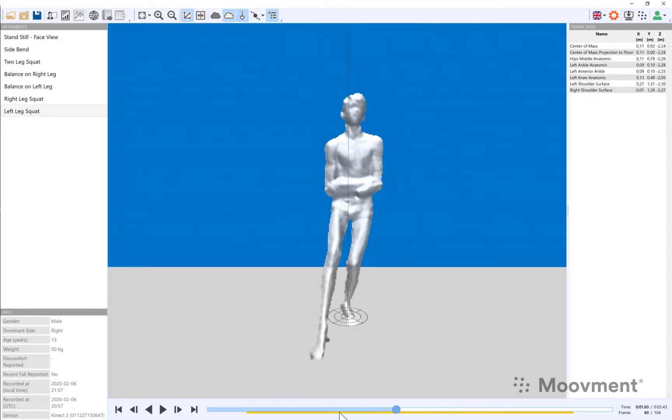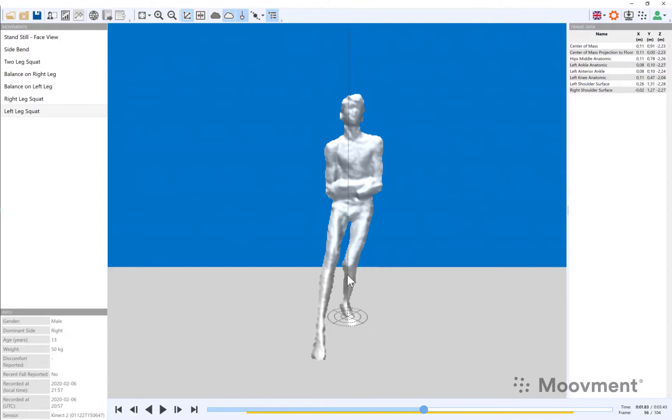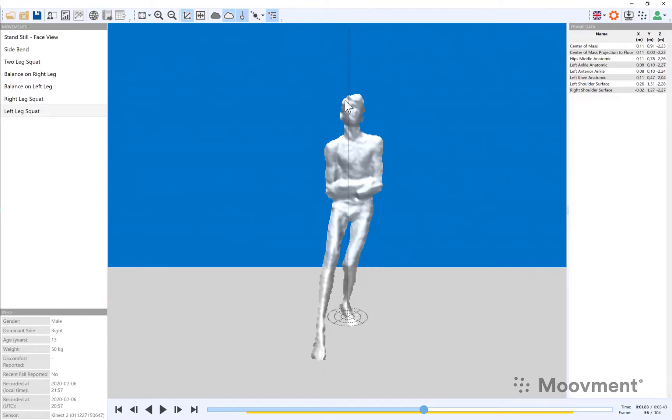In this case the left foot is pronating, the shank is vertical so the knee is over the foot, and some people might say that the knee is not medial to the foot and in that case it's not a problem. But in our opinion, even though the knee is over the foot, if the angle of the femur is so extreme and the hips are traveling laterally and the shoulders are compensating and even the head is compensating, then this is not a satisfactory performance.